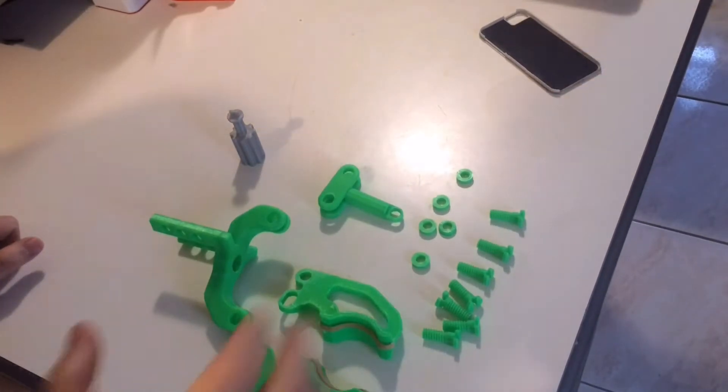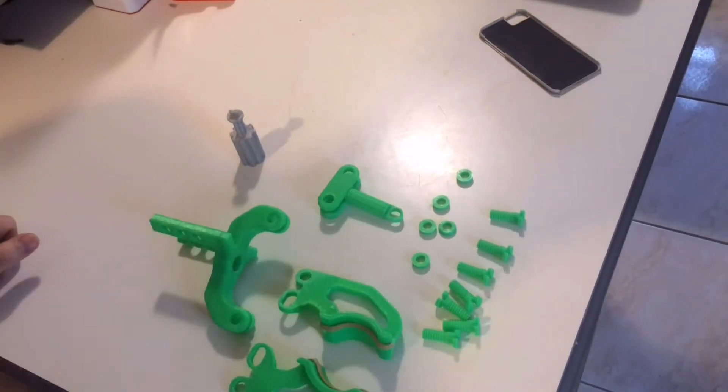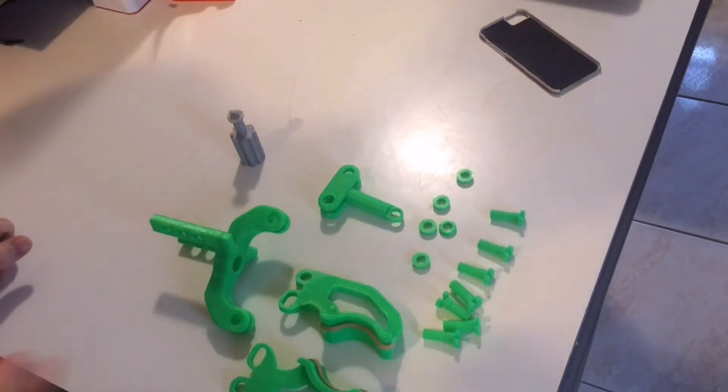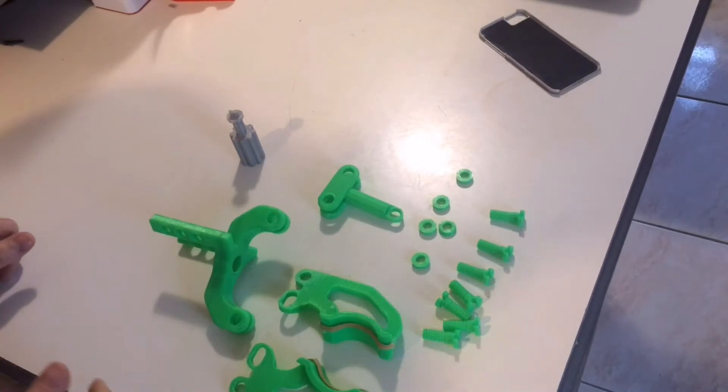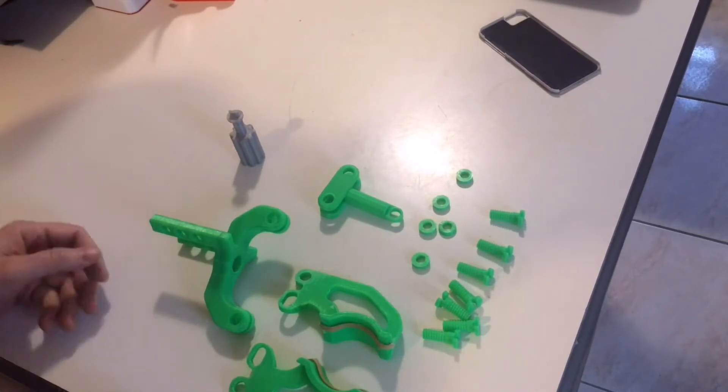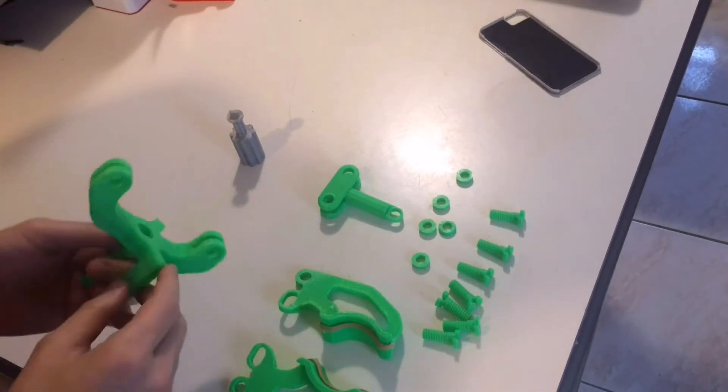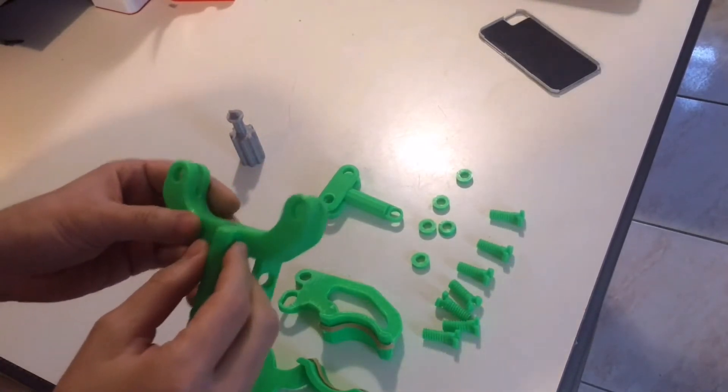These are all the parts for the simple claw, to hold like beverages and stuff like that. It won't hold anything too heavy. But anyway, let me start putting this bad boy together. But first, let me tell you.